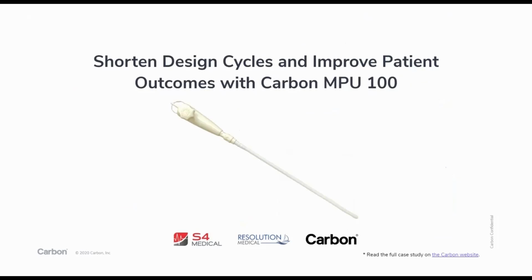One example of a medical device that is produced in MPU 100 is S4 Medical's eSolution device, which is pictured on the slide. The device is used to control the position of the esophagus during catheter ablation procedures. I wanted to highlight how S4 Medical worked with Carbon production partner Resolution Medical, and they selected the Carbon MPU 100 material because it meets the needs of their application, which includes contact with the esophagus. The decision to produce parts with Carbon allowed S4 Medical to shorten their design cycle, and the device is currently in early clinical trials. If you're interested in learning more about this application, the full case study can be found on the Carbon website.